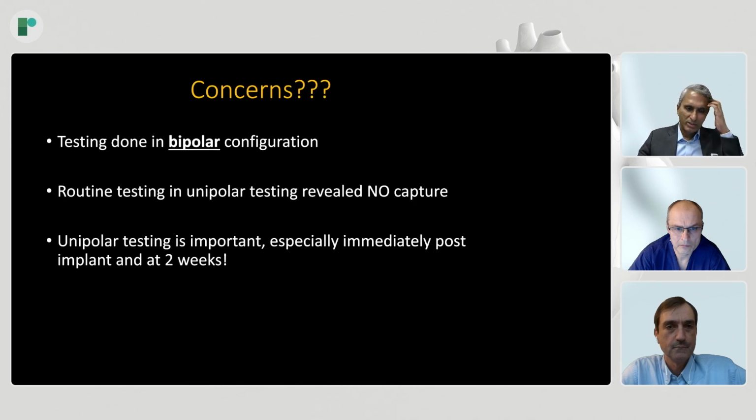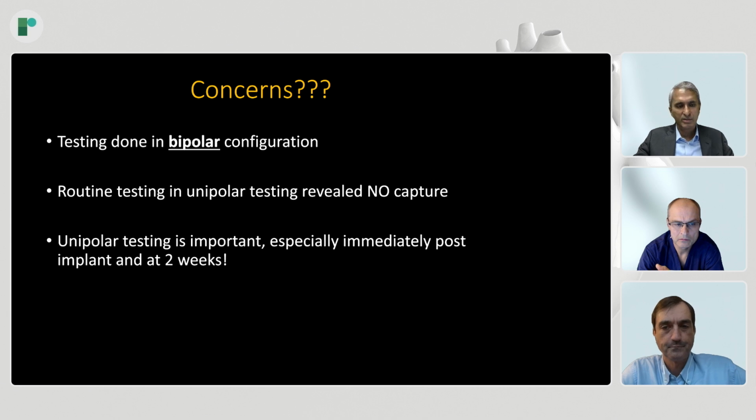So this is the question for the panel. What is the routine in your center? Do you do unipolar and bipolar, which was our standard? Occasionally some physicians or technicians, when they do the testing, forget to do unipolar. So how do you practice? Is it always both unipolar and bipolar, or do you program unipolar? Marek, what is your practice in your center? And Oscar, you can answer after that.